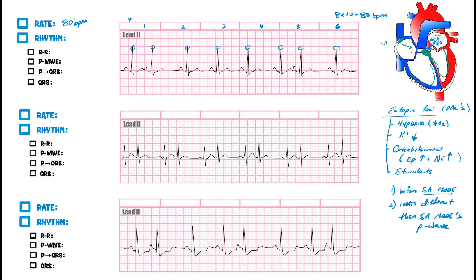Next, we determine rhythm by looking at the R-to-R intervals. The spacing is inconsistent — it goes about two and a half, then one, two, three, four, then shorter again. This is definitely irregular because the R-to-R intervals are not consistent.